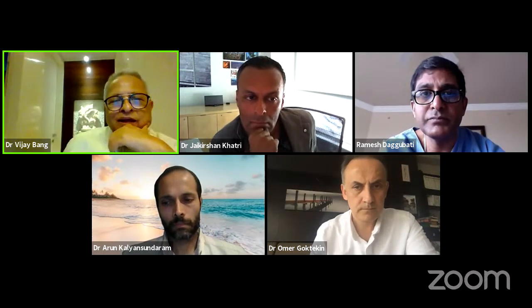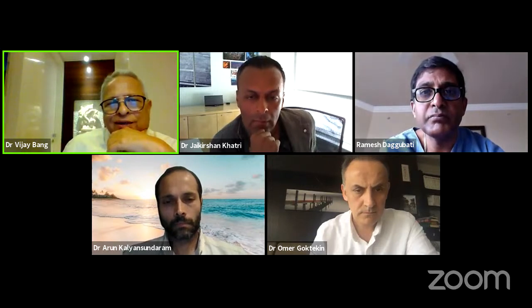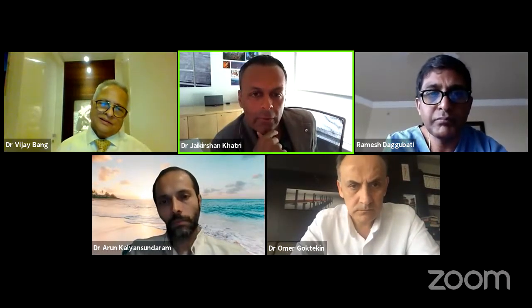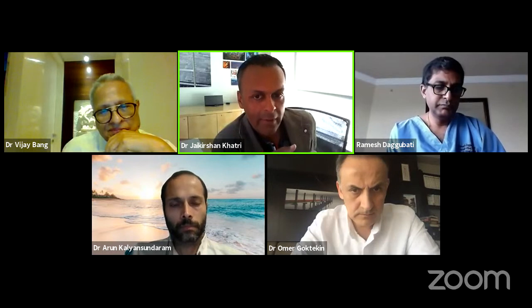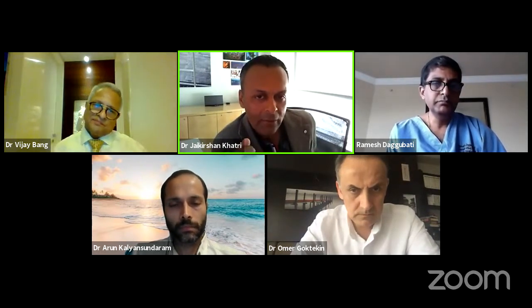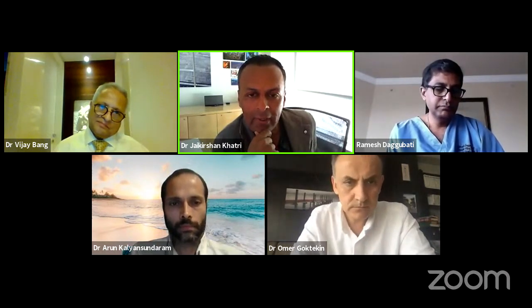Right, absolutely. Does any one of you use MDCT in your lab as a co-registration for cases, and how does it help? Jay? Yeah, we use it. Okay, Jay, Omar, both of you, please answer this. We use it, honestly, what we found it to be most useful for is understanding the path of the artery even before we get in. The co-registration is not as useful as pre-planning the case beforehand. We actually recently published a case where we 3D printed the CT angio of an anomalous RCA that came off the left cusp, and then practiced beforehand shaping guide catheters to understand how best to engage the coronary artery. So I find it to be much more useful for pre-planning rather than in the case.